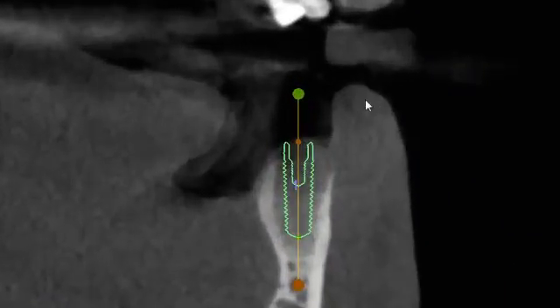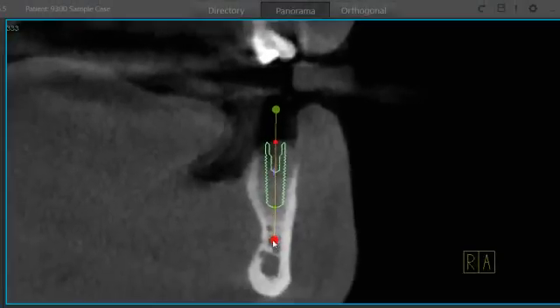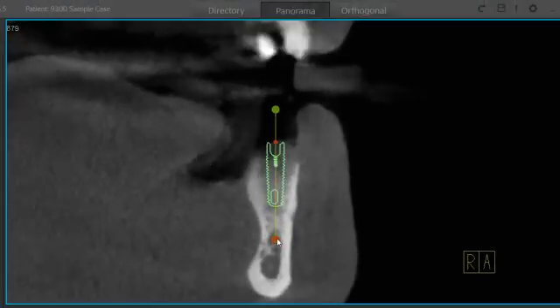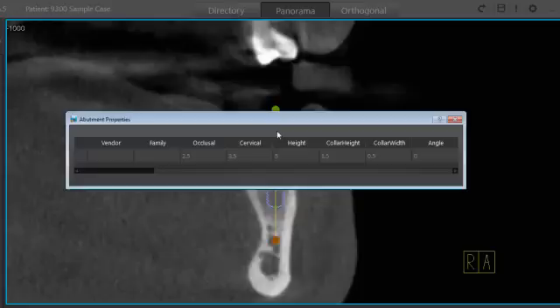I'll select it and start by dropping the implant into my cross section. From here it's very easy to move the implant around — I can left click and move it bodily, or grab the occlusal anchor point to adjust the angle very easily. I can roll through my slices, and if you want, you can go ahead and throw an abutment on and make changes to it as well.